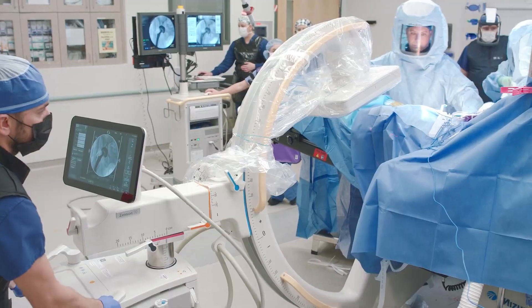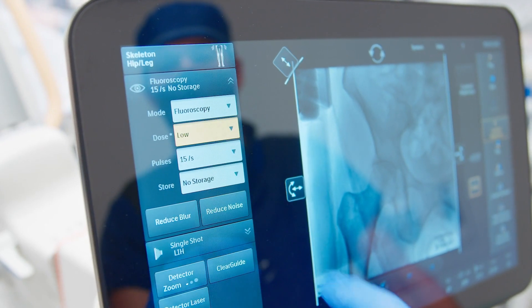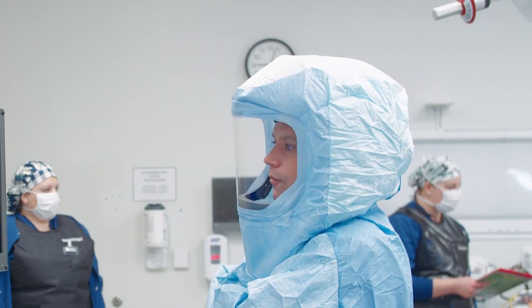In orthopedics, the use of fluoroscopy happens multiple times a day, multiple days a week, so the additive effects of radiation are important. Anything that can decrease that — whether it's a low dose setting like the Zenitian has, or the ability to capture those images the right way the first time — is a safety factor that I and every orthopedic surgeon thinks about.